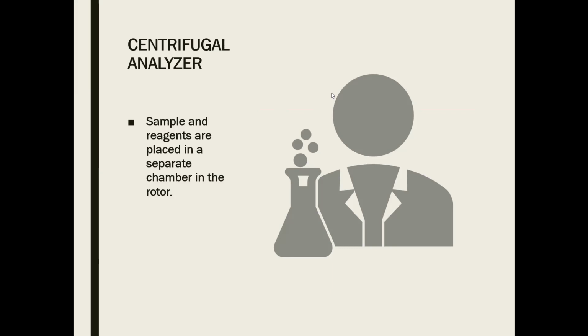Take note that the product then moves to the cuvette portion. That is our centrifugal analyzer.